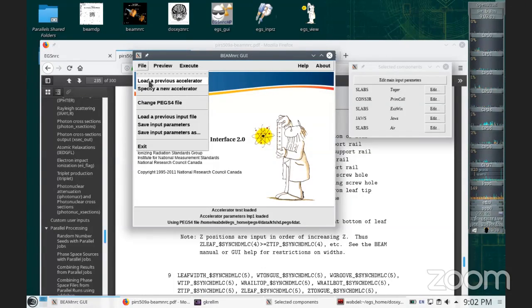Okay. Dr. Omid, what do you think, maybe let's say we have a collimator and then we play with the settings of the collimator. If we have the geometry, then we can at least have the drawing with the collimator, then we move to the target and so on. But I think starting from A to Z and making the whole linac will take a huge amount of time.